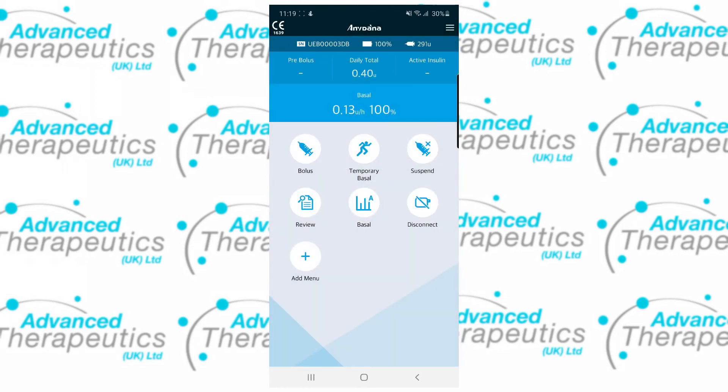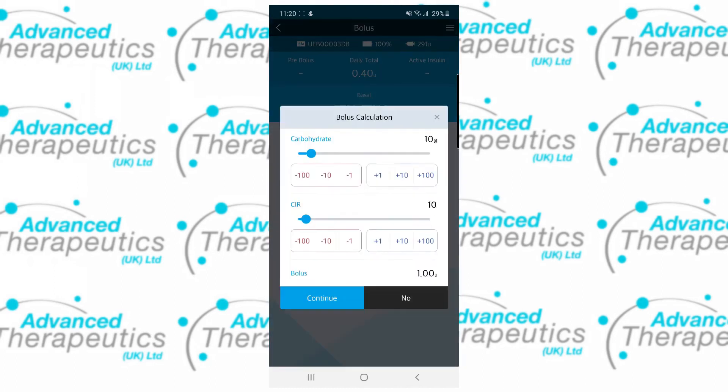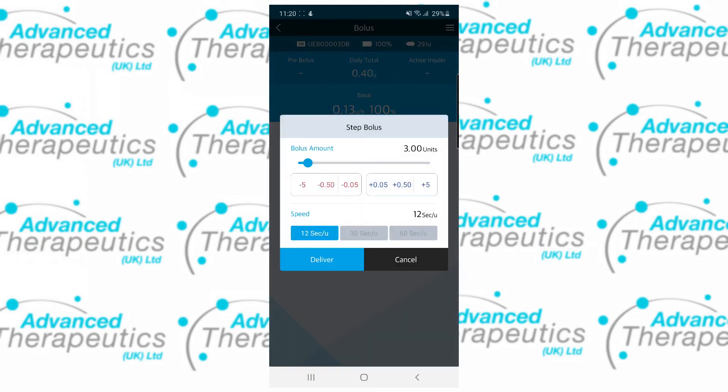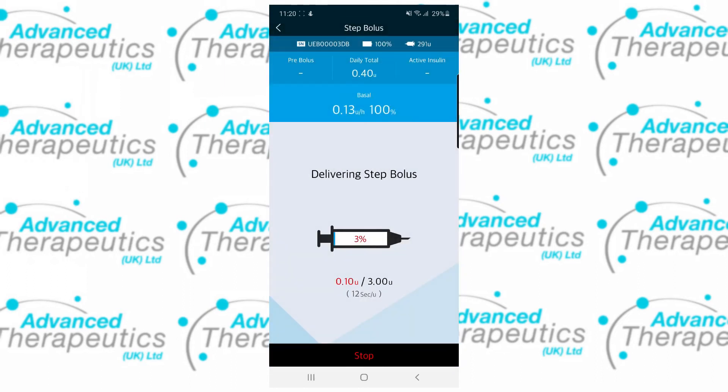Back on the home screen you've got access to bolus features. Inside of bolus you'll find two calculators as well as another way to get to your bolus settings. The first calculator is a carbohydrate only calculator for top up carbs and snacks. Your three different options for delivery are step, extended and dual pattern. Inside of a step bolus you can vary the speed of delivery as well as vary the insulin amount, and deliver from the pump and stop the delivery at any time, instantaneously.